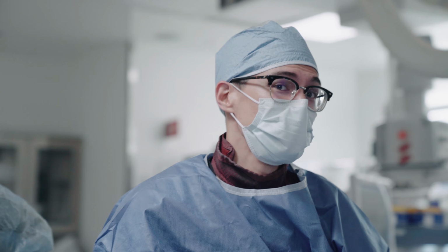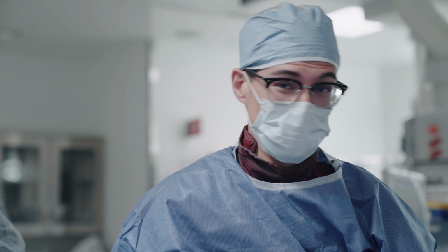Found a few varices. These have a high propensity for bleeding, causing gastrointestinal bleeding. So what we're doing is we've selected into them and we're coiling them off to prevent bleeding.